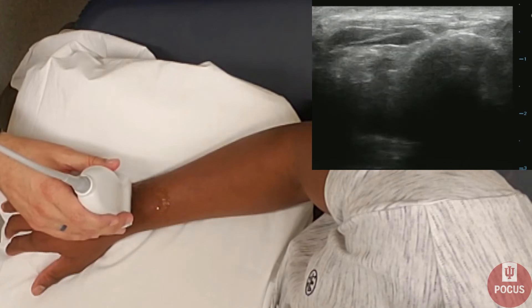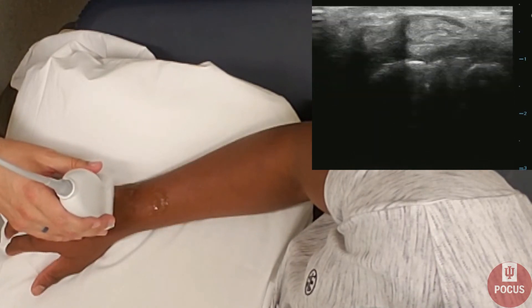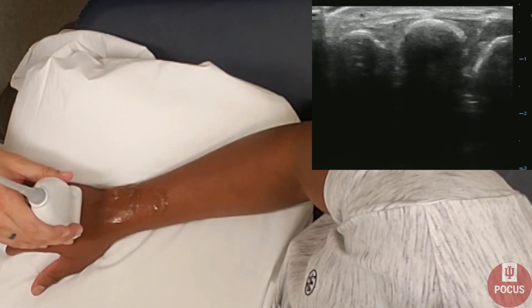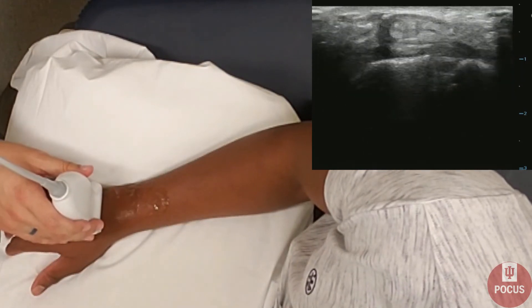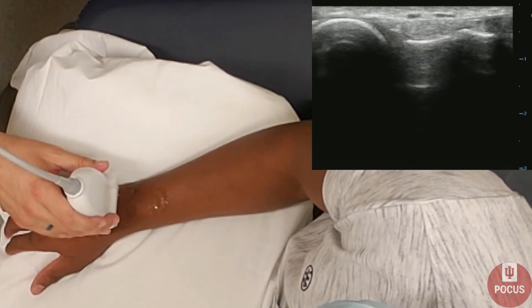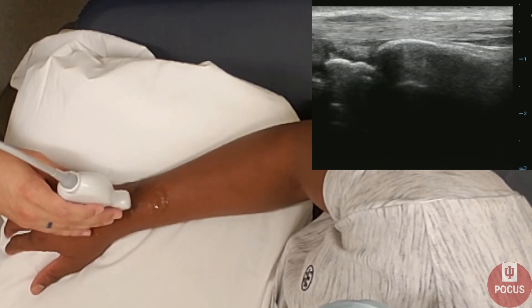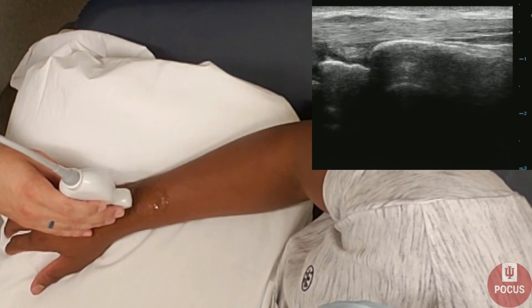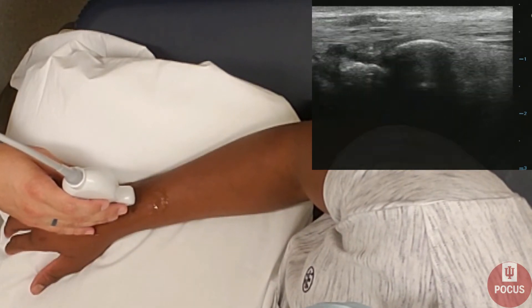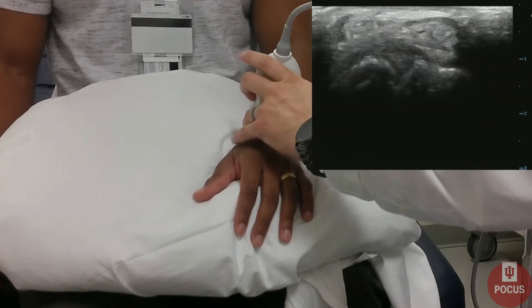We can evaluate each tendon both in short axis, both proximal and distally across the wrist. And if there's one particular tendon we're interested in evaluating, we can look at it in long axis as well, for any change or disruption in that typical cable-like fibrillar structure.